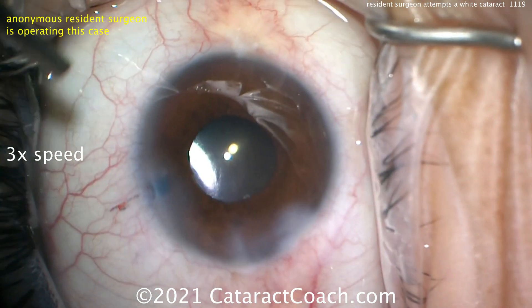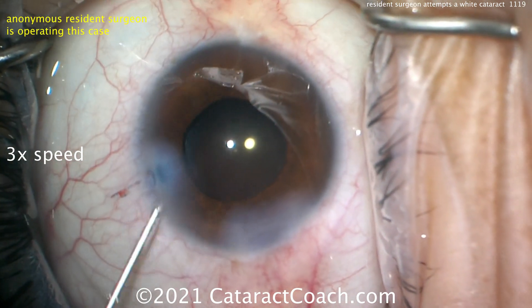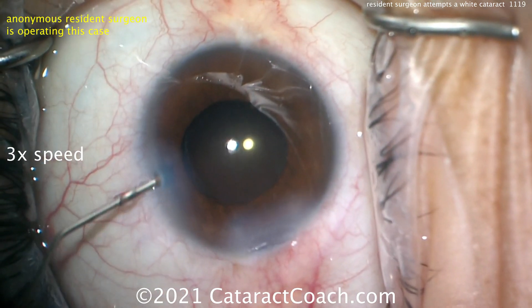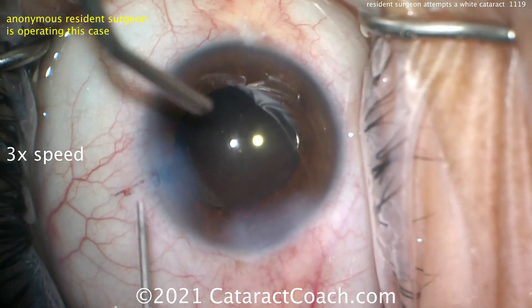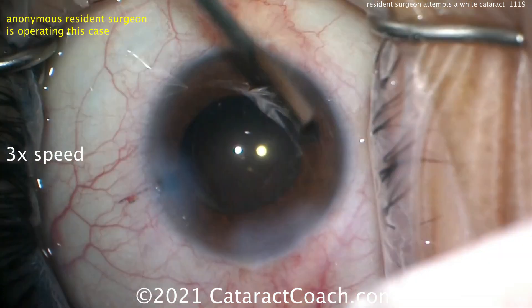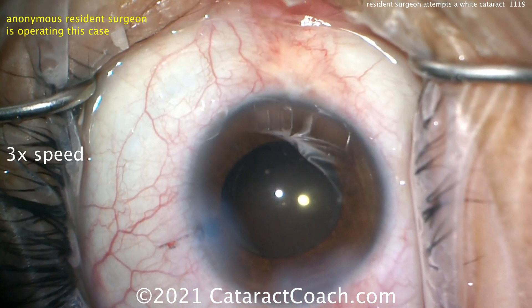Now here's where you really want to use that chopper — lift up the iris to ensure the lens is in the capsular bag. With the infusion pressure, you can see it looks pretty much in the bag. We can tell for sure when we get those reflections of light. You can see the first and second Purkinje images — those two little dots in the center. Really nice job. I like the sealing of the incision. This patient is going to be so happy. Case number 50 — I'm blown away. Case 500 will be even better, and I can't wait to see you operate on case number 1,000.